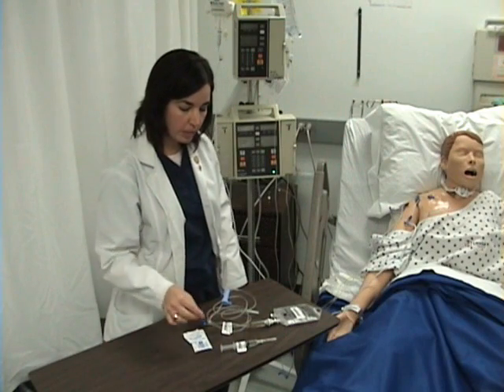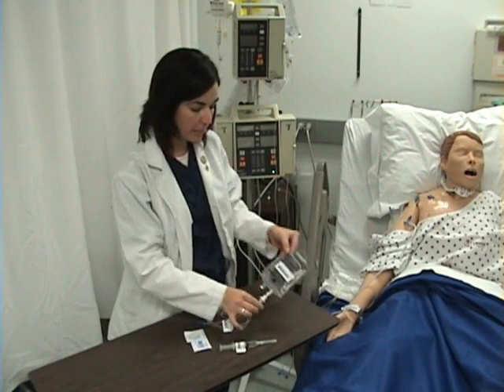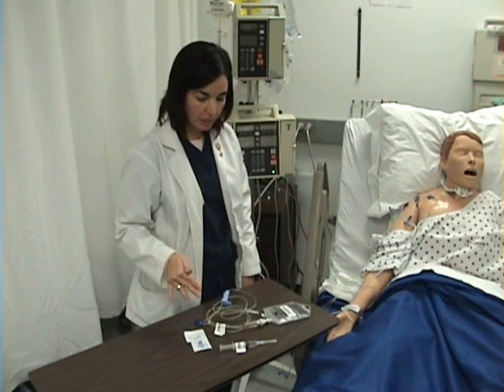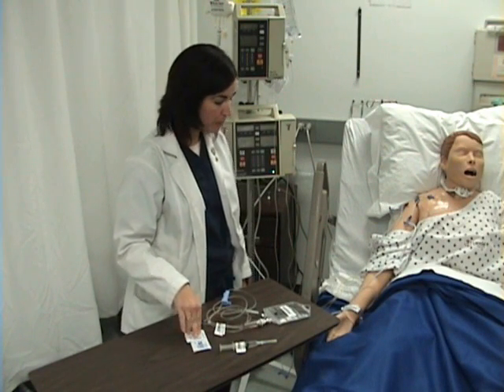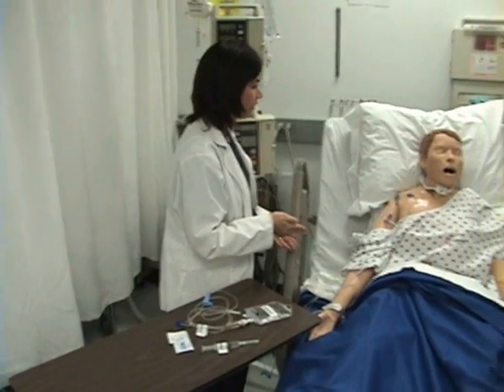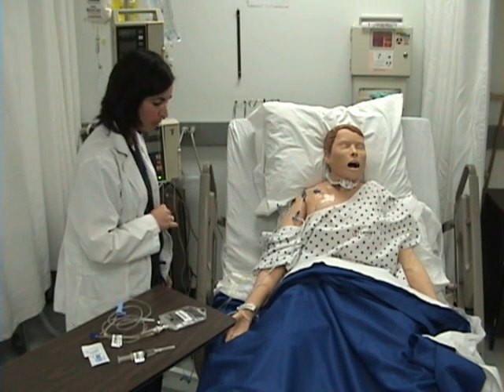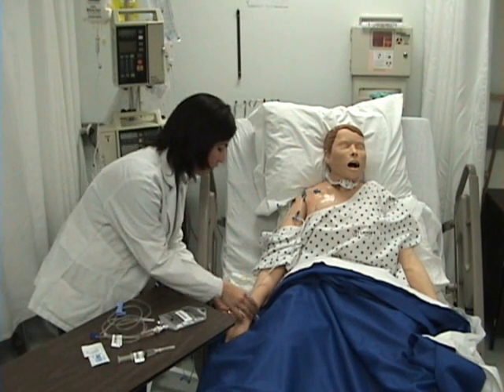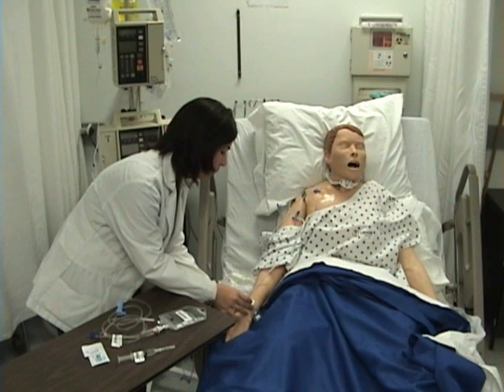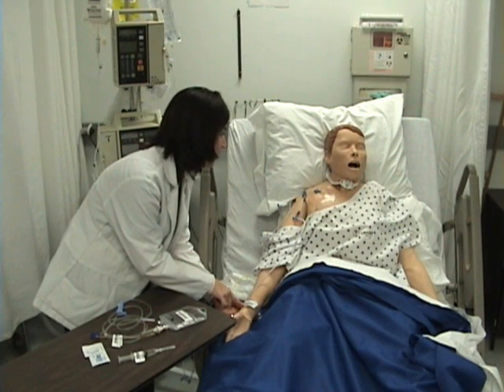The patient has been ordered to receive IV Push Reglan and IV Piggyback Nexium. I have gathered my supplies with my alcohol preps, entered the patient's room, washed my hands, and introduced myself to the patient. I will explain to her that she will be receiving medications, then ask her to state her name and date of birth as I check her identification bracelet. I will also ask the patient if she has any allergies.